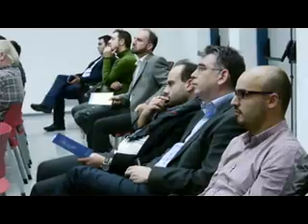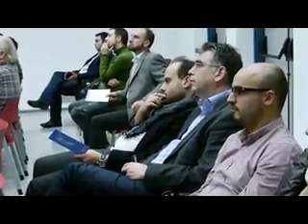I want to ask you, these last cases that you showed to us with the adenomyoma and the cyst, do you use, as the previous cases, the ultrasound scan at the same time? Because, okay, you can measure the thickness of the uterine wall, but still we all have the fear that we will perforate. So ultrasound is an absolute necessity within the operative theatre. You don't need laparoscopy, you need ultrasound for this kind of surgery.